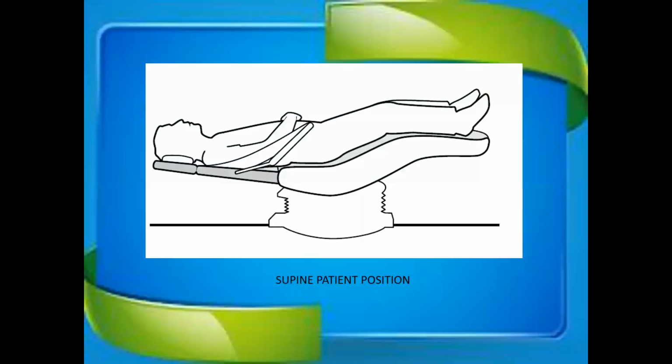Patient position. Mostly the patients are positioned during dental treatment in a supine position, that is almost horizontal or parallel to the floor.